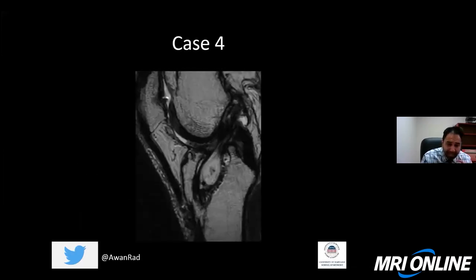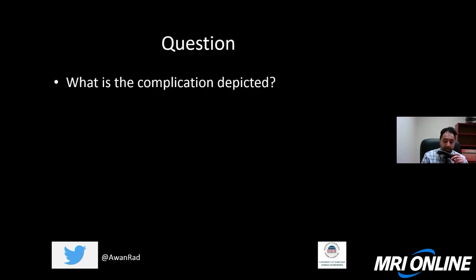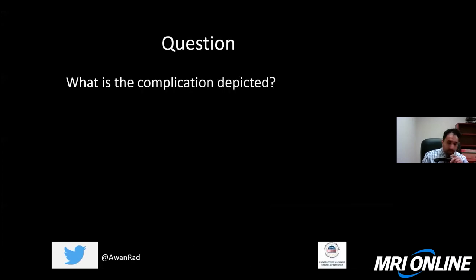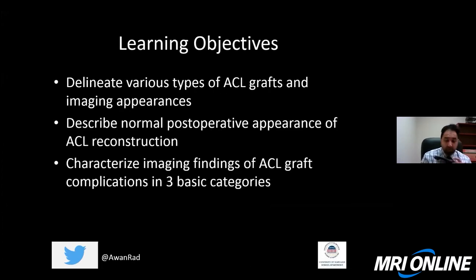In case four, the last case I'm going to show, we have a sagittal T2-weighted image through the knee in a patient that's had an ACL graft, and there is a finding and abnormality here. What's the complication that I'm showing you on this image? We're going to come back to all four of those cases at the very end.